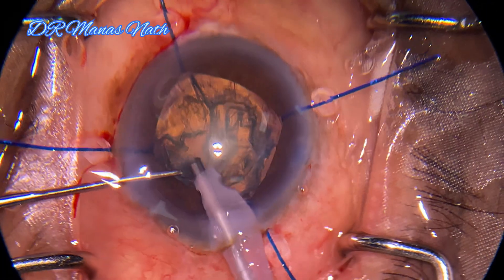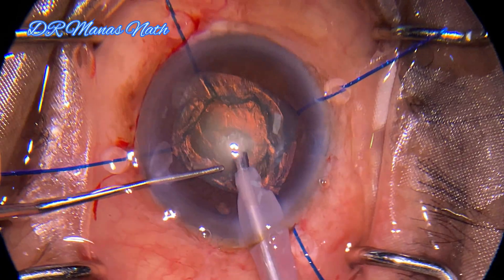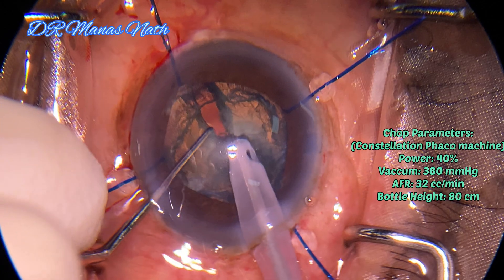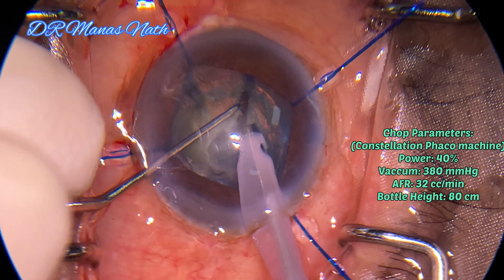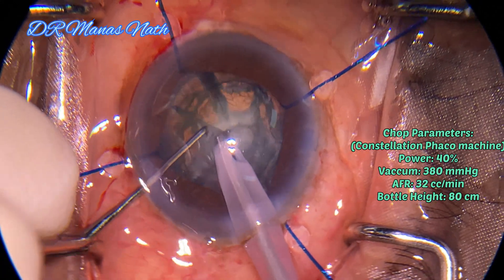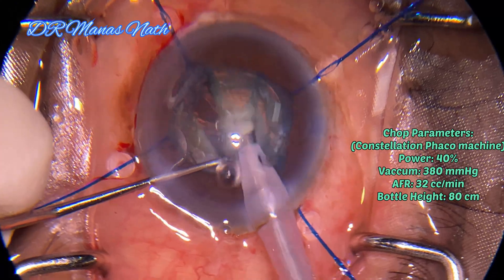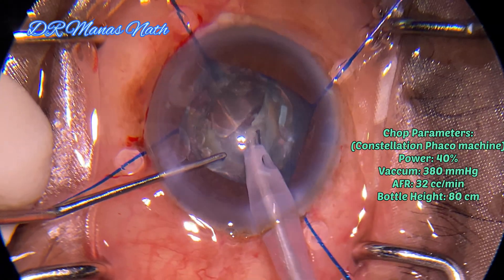Starting phaco emulsification with lower parameters, removing some of the superficial cortex, then creating a short deep trench and starting a stop-and-chop technique with lower parameters. This is the first chop, the second chop, and the third chop. Two nuclear pieces have already been created and emulsified. As we know, in posterior polar cataract there should be no or very minimal rotation of the nucleus.